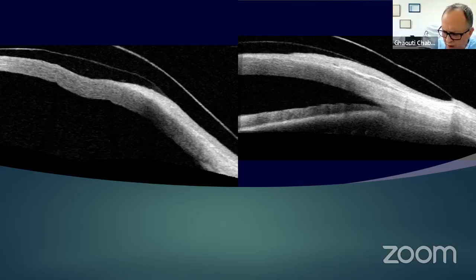We have a question. It's in French. I'm sorry, but I will try to translate it. Est-ce que vous utilisez des autres indices quantitatifs pour minimiser les HOA ou bien seulement PSF? Do you use other quantitative indices to minimize the higher order aberration, or just the MTF? Do I use other values which your aberrometer is giving to you, such as RMS and.